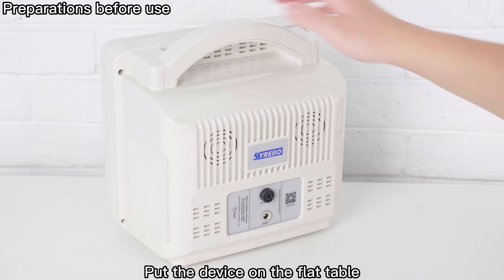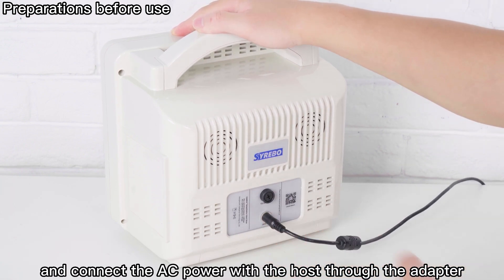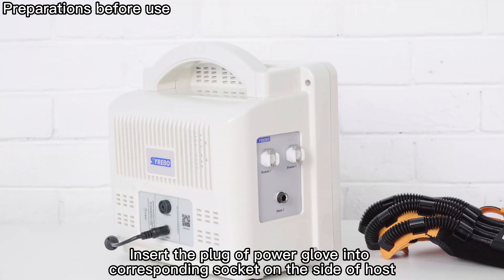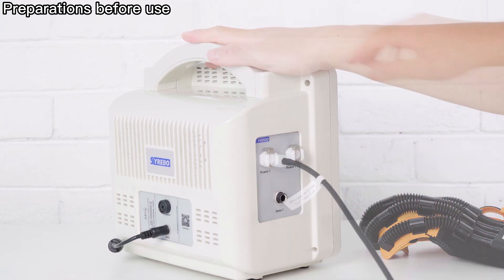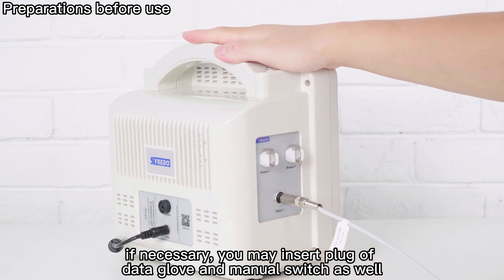Put the device on a flat table and connect the AC power to the host through the adapter. Then you can see the power indicator on the host is on. Insert the plug of the Power Glove into the corresponding socket on the side of the host. If necessary, you may insert the plug of the Data Glove and Manual Switch as well.